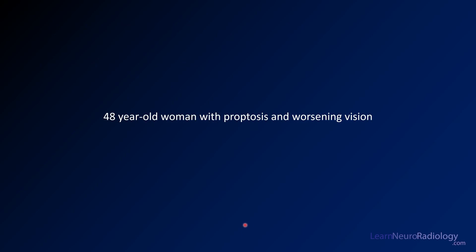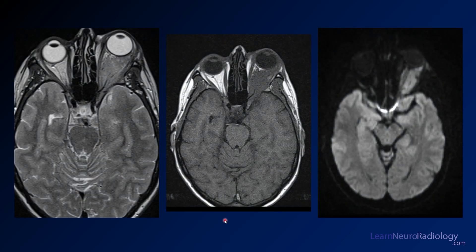The first case is a 48-year-old woman with proptosis and worsening vision. Here you see MR images showing clear proptosis on the left. Normally the interorbital line should pass through the central third of the globe, but here the globe is pooched out. On T2, you see a mass-like infiltration — intermediate T2 signal within the orbit.